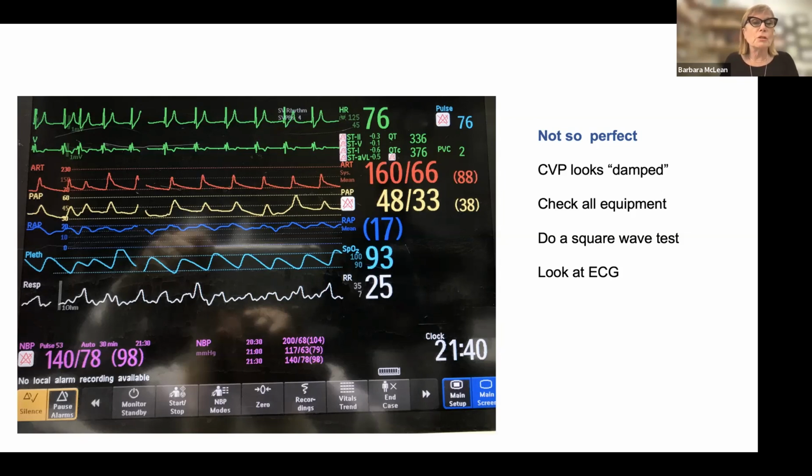Now, I can also do a square wave test. I'm not here to talk about square wave tests today, but if you've been on before, you'll hear a square wave test is when I change my scale to 300, pull my pigtail, and see that I get a square wave, the top of the wave actually at 300 millimeters of mercury, which tells me that my equipment is okay, not the patient. But I always want to remind myself, I'm looking at that EKG.